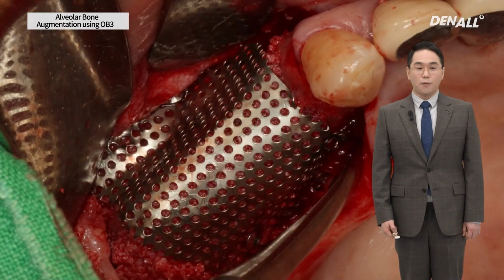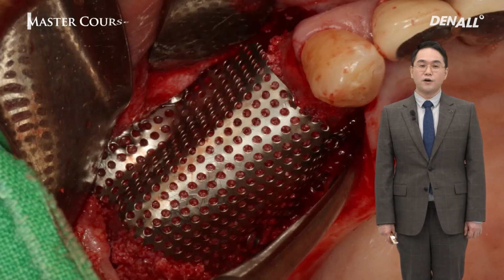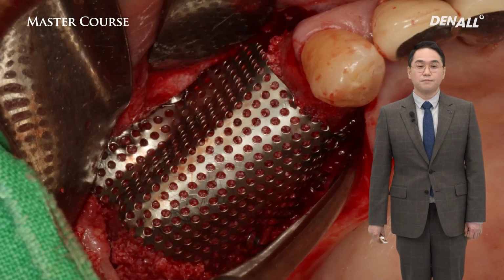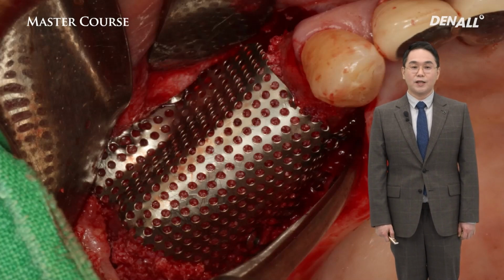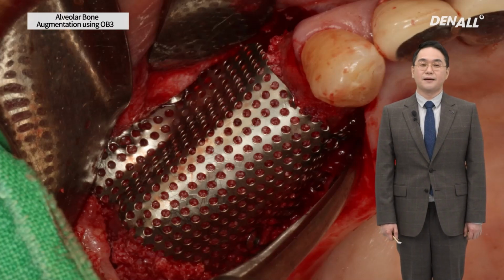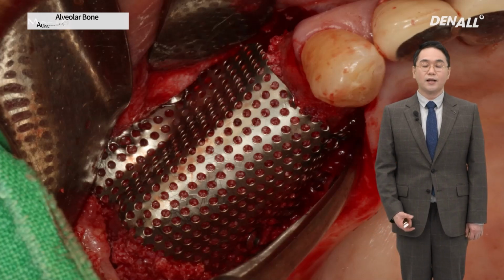And then the graft materials are covered with the titanium mesh. On the palatal side, it is fixed with the bone screws. The standard titanium mesh is different from a general membrane as it has poor adaptation capability. As titanium mesh is metal, if it is not fixed, things below it will move. So the bone graft material would be exposed or will be unfavorable for bone regeneration. So what is important for titanium mesh is stable fixation. So standard titanium mesh would be fixed with the bone screws.